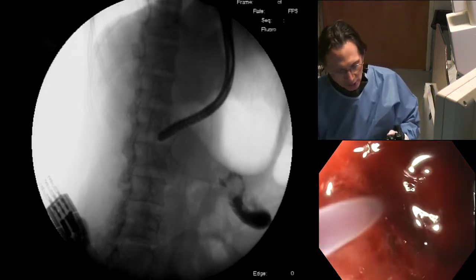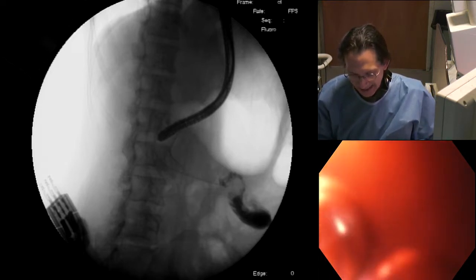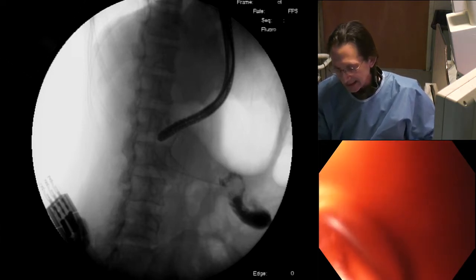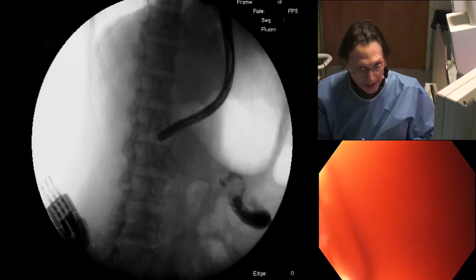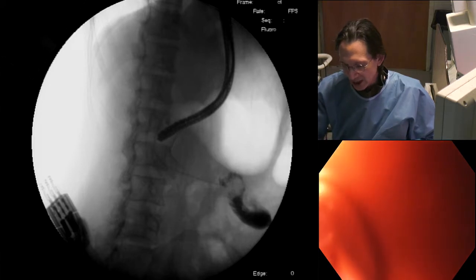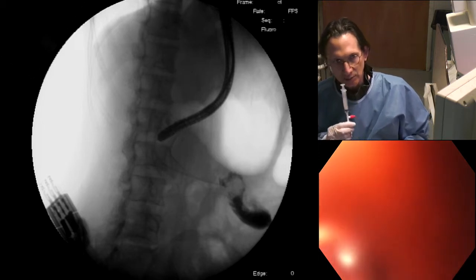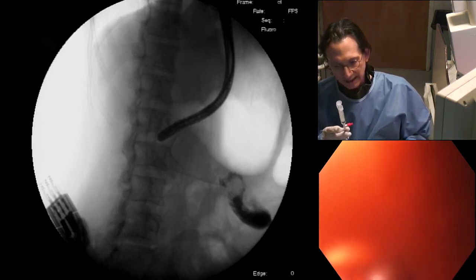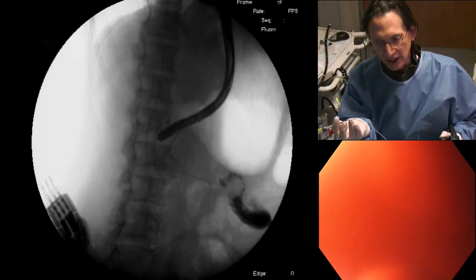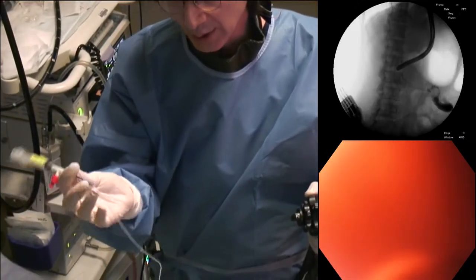Now, what we want to do is leave this catheter in there so that we can continuously irrigate. The challenge, however, is how do we remove the scope, leaving the catheter in place? The only way to do this is by cutting the catheter, and then we're going to attach our syringe directly to the catheter. There's no way right now that we can remove the scope, leaving the catheter in place without cutting the hub here. So we're going to have to cut here, but then we can use a needle to infuse water through this catheter.